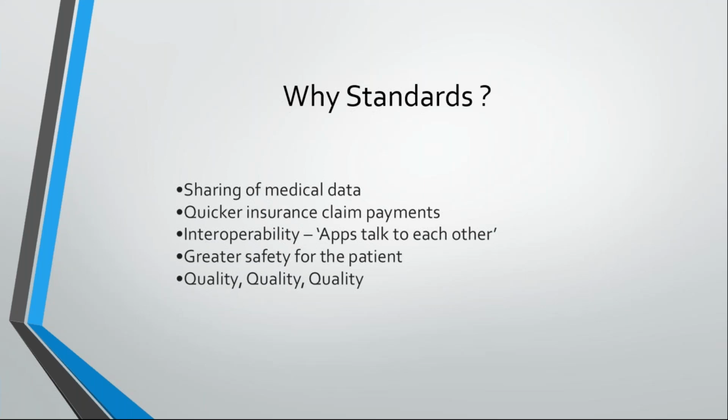And obviously, these standards are enabling the applications to talk to each other. So when two or more applications are talking to each other, which is nothing but transmitting the data with each other, it is called interoperability, as we are enabling the data exchange between different systems.